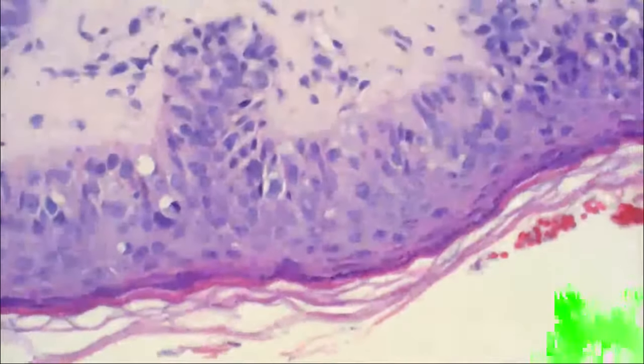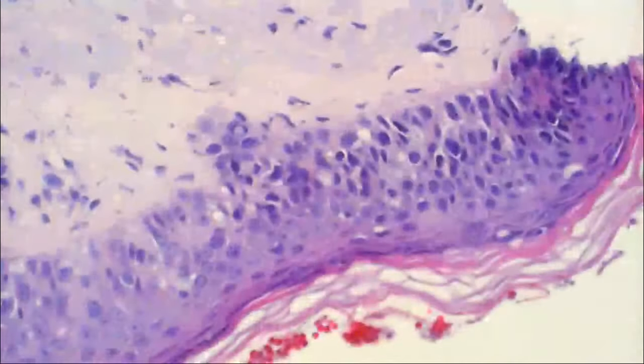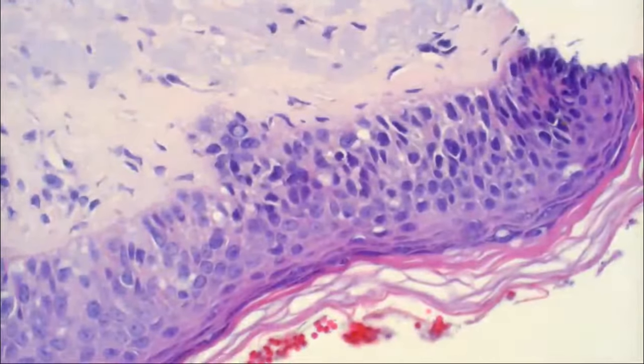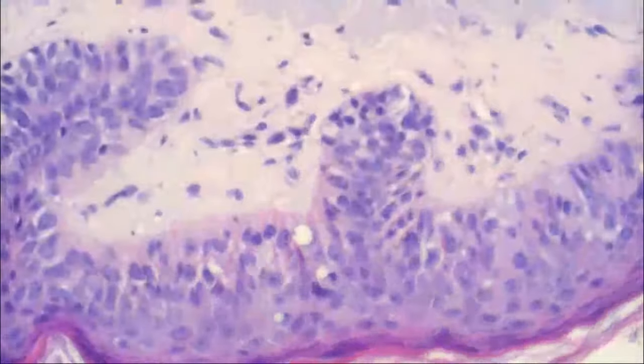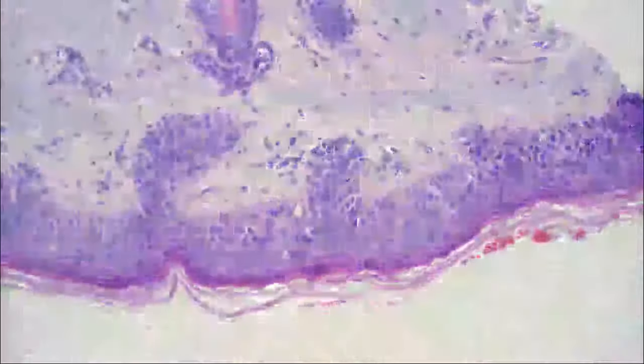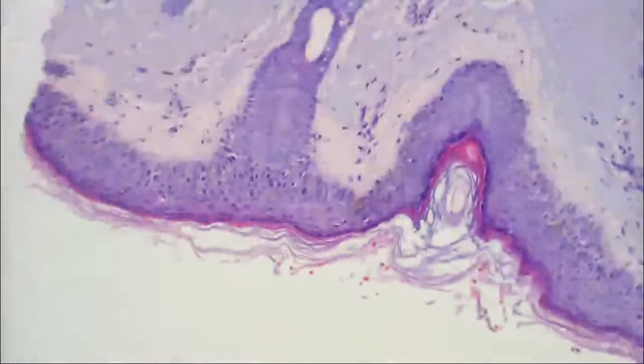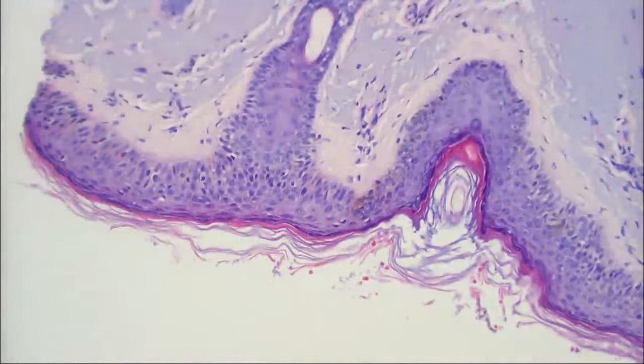There's a couple others that you should just know about. Langerhans cell histiocytosis, mycosis fungoides, so-called pagetoid reticulosis, can do it. Merkel, sebaceous carcinoma. So there's not a ton of lesions that can give you this sort of pagetoid involvement. Because this wasn't full thickness over a broad front, we call this a Bowenoid actinic keratosis. But basically, the most important thing is just to remember the differential diagnosis, because you wouldn't want to miss melanoma in situ here, obviously.